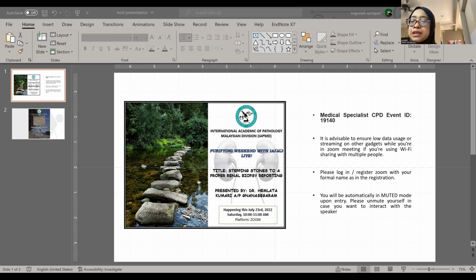Basically, hi Dr. Hema, is an immunofluorescence finding of IgA 1+ or plus minus enough to conclude IgA nephropathy? Okay. I know I find this tricky as well. Those days, I would say 2+ and above is the best. You need 2+ and above, then you will consider it as positivity. But we know that with IgA, you can also have a smaller amount of deposits. So you still can have 1+ to 2+.